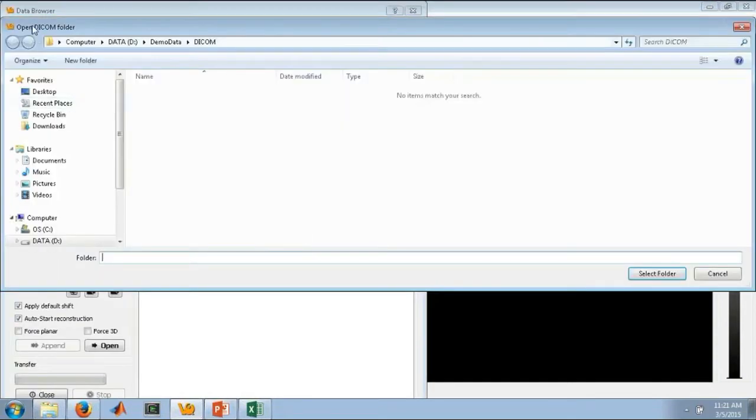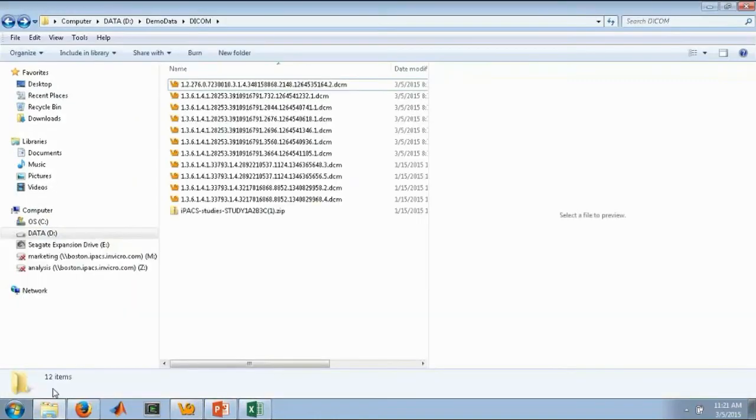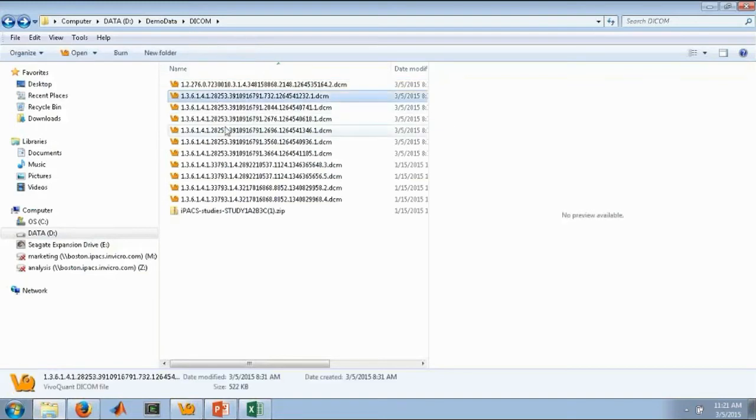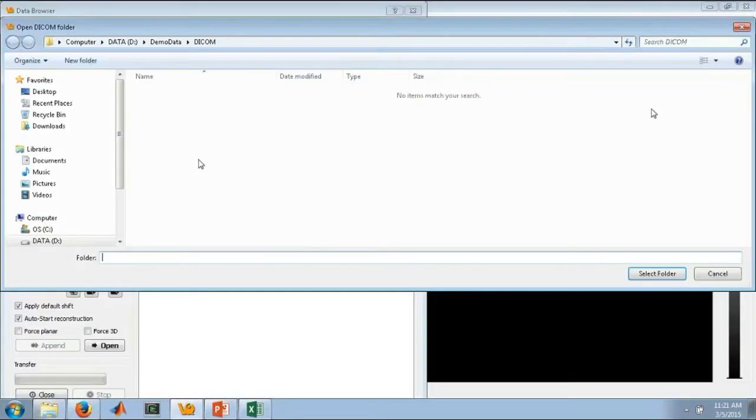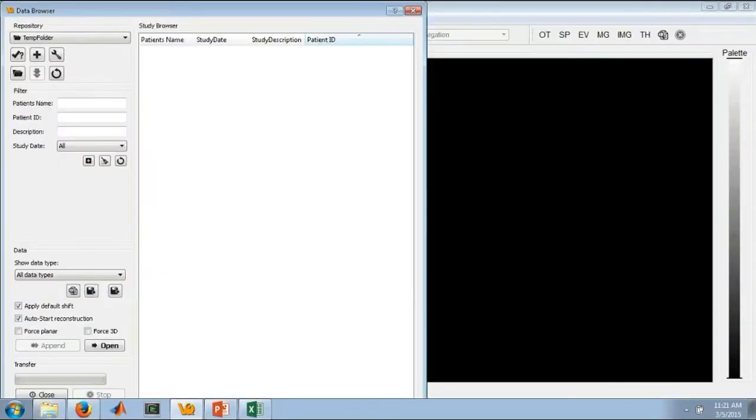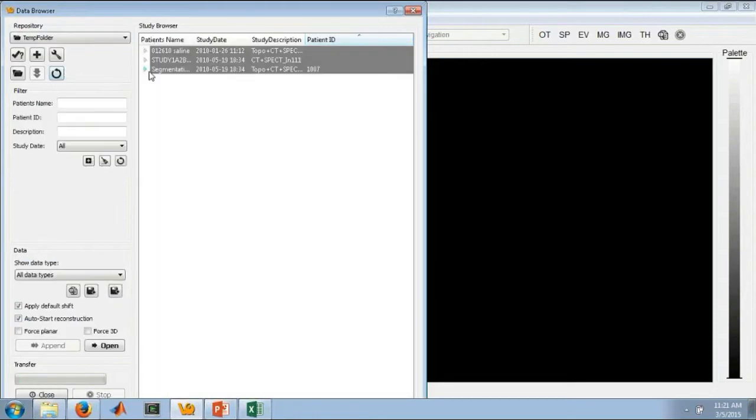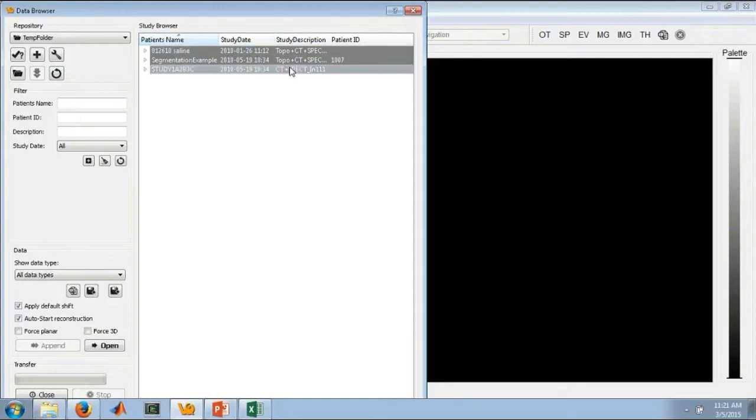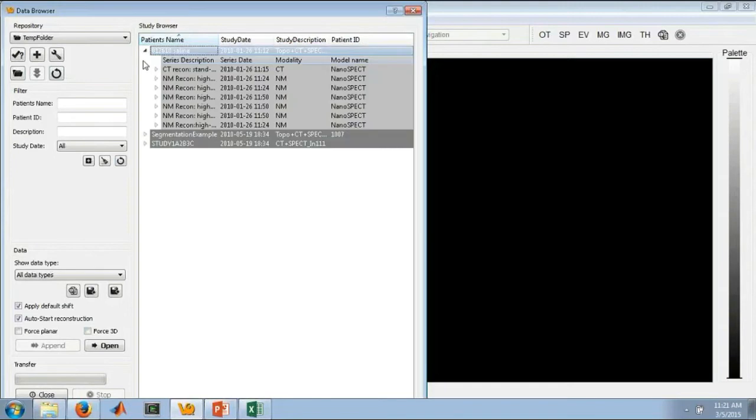Here it brings me to a local DICOM folder. You'll see the same folder contains all of my DCM files, but these are really just a pain in the butt to work with. Everyone knows, nobody wants to try to figure out what data they're looking at by the UID. We've handled that for you. By selecting this folder and refreshing, you see here are those data sets that we were just looking at, now organized based on the DICOM standard using the patient name, study date, study description, and patient ID, and organized based on the study instance and series instance UID.